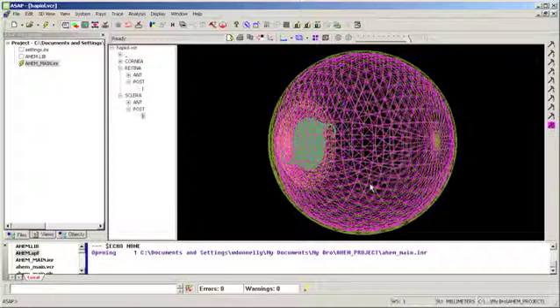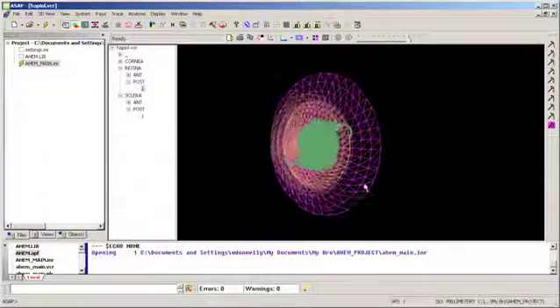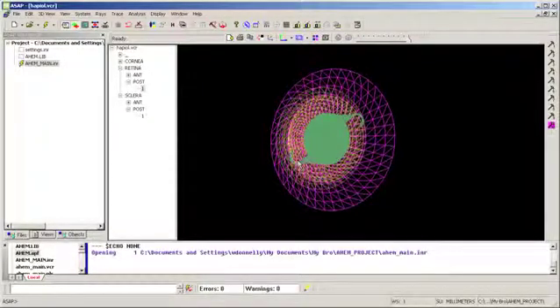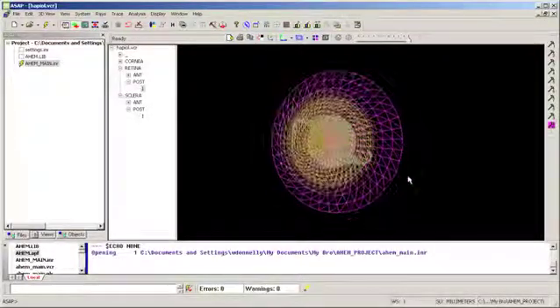So I'm going to remove some surfaces here. I'm going to remove the sclera and the retina. And here's my intraocular lens in the green. And we see haptics around that lens. And this is the front of the eye.